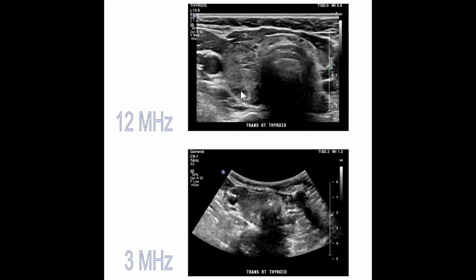So our 12 megahertz transducer is giving us a beautiful amount of detail. So much information can be seen in these first 3 centimeters. This is why we use the correct transducer for the correct job. Compare that to this 3 megahertz transducer. If I wanted to image this patient's neck and the bed and maybe the floor behind them, then great, give me the 3 megahertz transducer. But this will do nothing for a diagnostic picture.